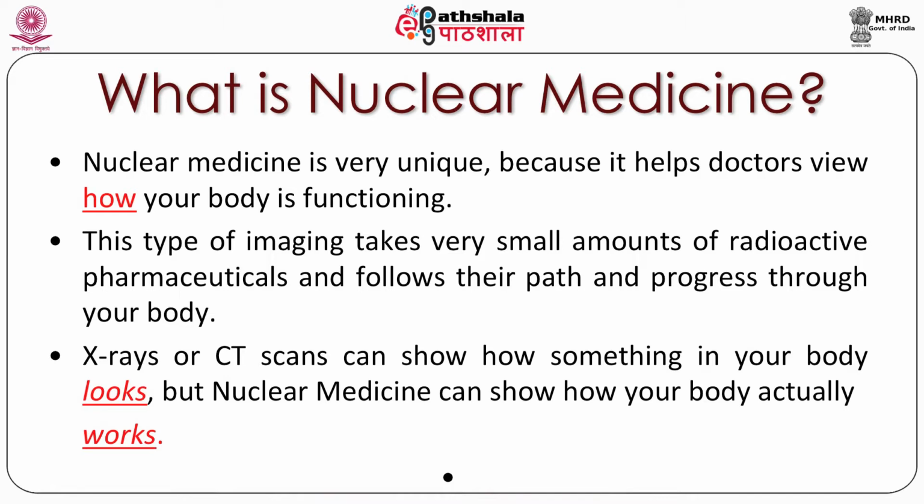This type of imaging takes a very small amount of radiopharmaceutical and follows its path and progress through your body. It means this radiopharmaceutical is acting like a tracer. When you inject or administer it, it goes into the body, mixes with the blood, and finally the pharmaceutical takes that radioactive material to the place of choice where you are going to diagnose that particular organ.